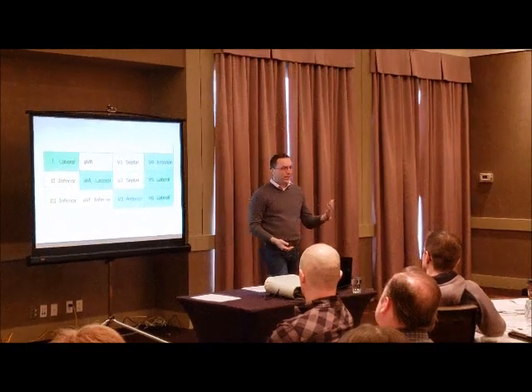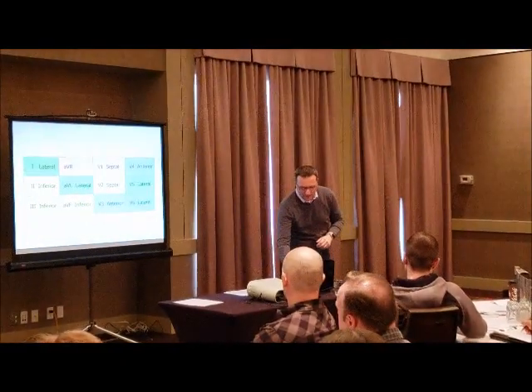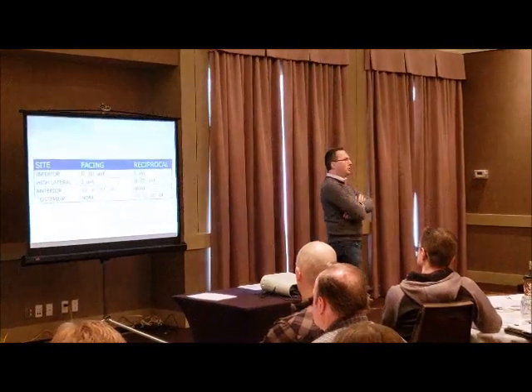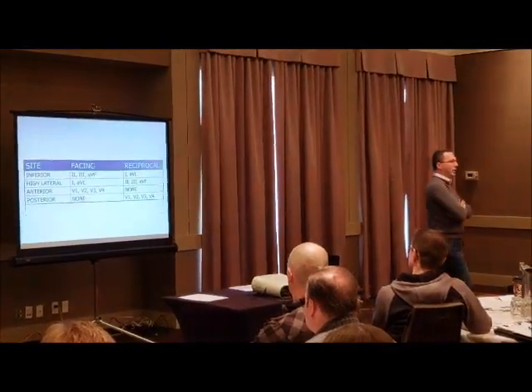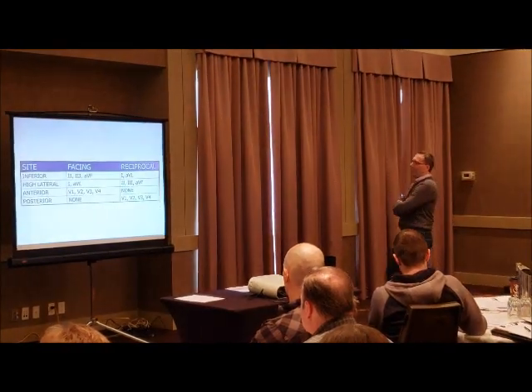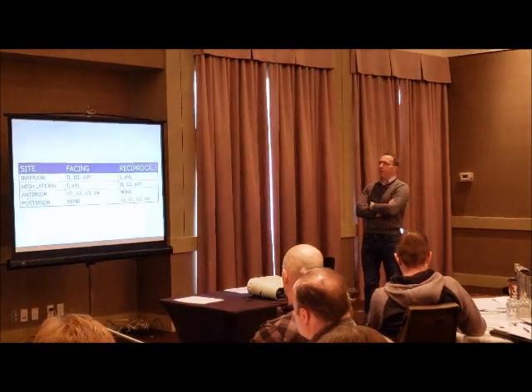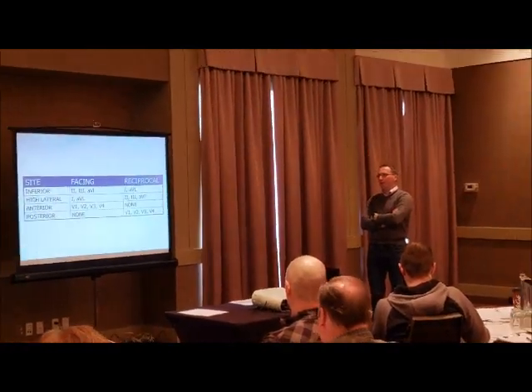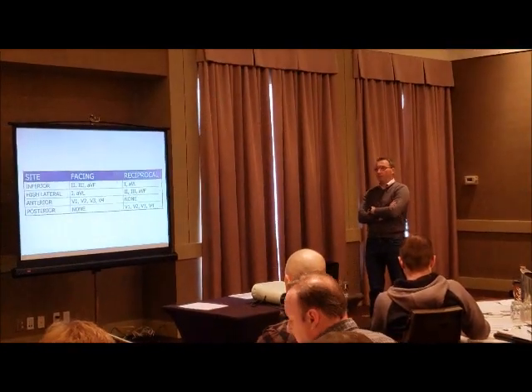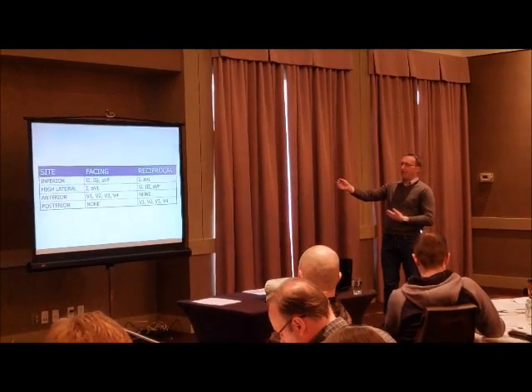But again, you've got to look at the actual infarcts for this to make better sense. Similarly, we'll say the same thing about reciprocal changes here. It is true that the inferior and the high lateral leads are reciprocal to one another. So inferior ST elevation in 2, 3, and AVF, the reciprocal changes in the high lateral leads, versus ST elevation in the high lateral leads, reciprocal changes in the inferior leads.